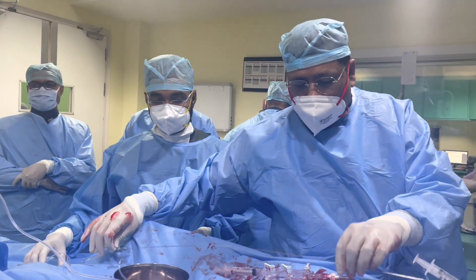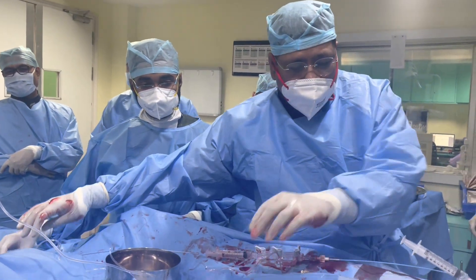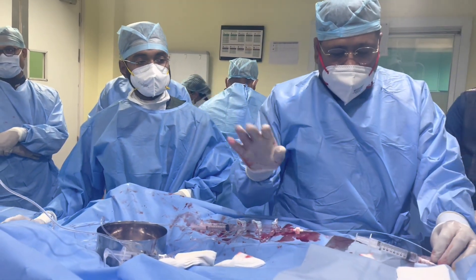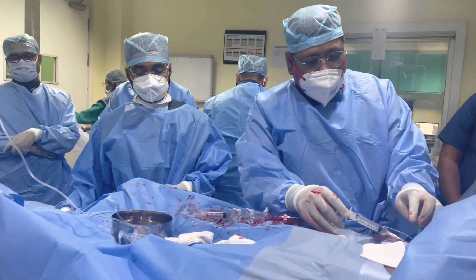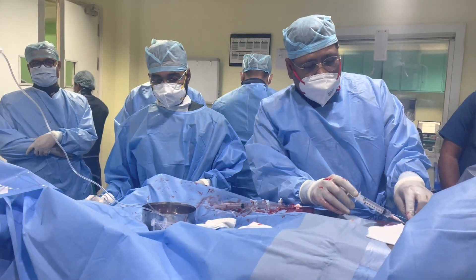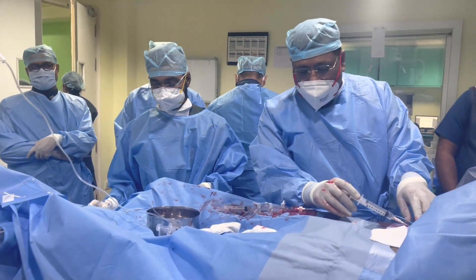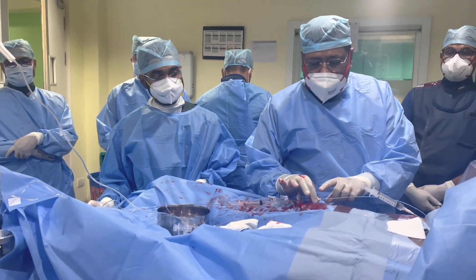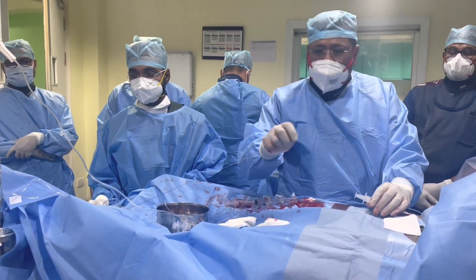We are going to show you the steps of septal puncture today. We have a femoral vein line and an arterial line. The pigtail catheter is there — I will show you.